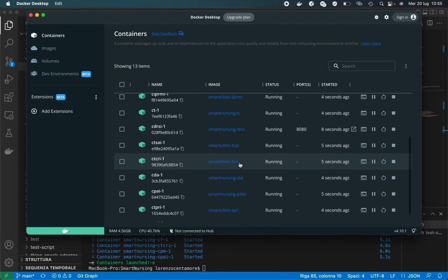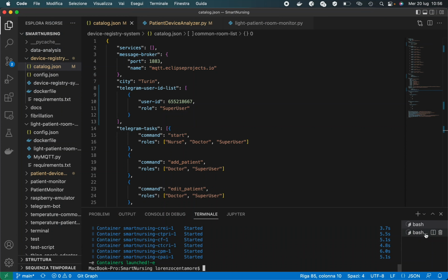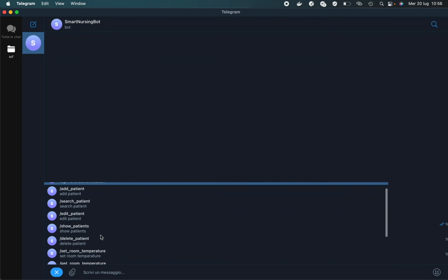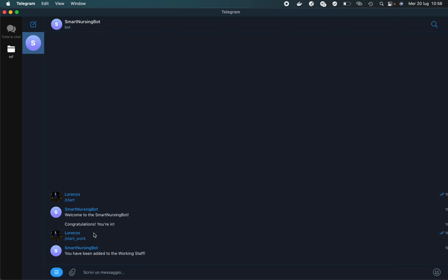Let's start by opening the Telegram bot. There are three possible users: nurses, doctors, and super users, who can do the operations of both. Now I'm a super user, so I can manage patients and receive notifications. I will log in and start work. That means the user has started his work shift, so he can receive notifications. When the user ends his work shift, he can click on end work to not receive notifications.